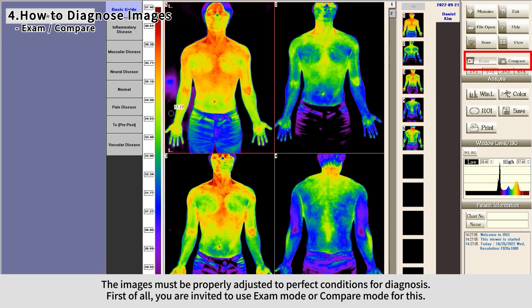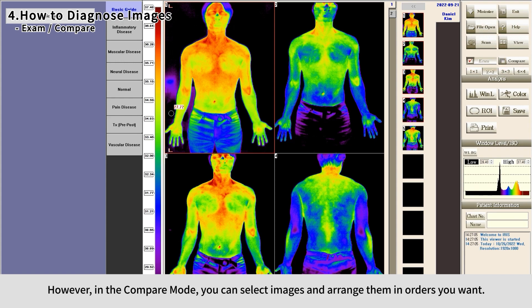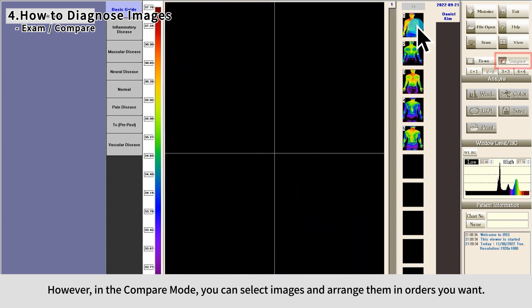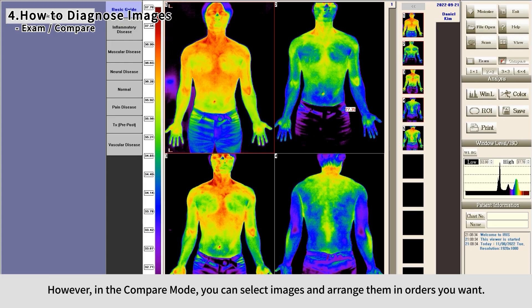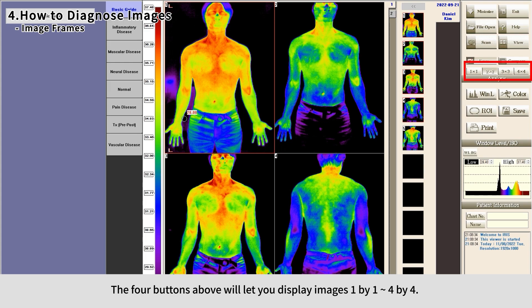You can use Exam Mode or Compare Mode for reviewing images. Exam Mode displays images in the order they were taken. In Compare Mode, you can select images and arrange them in any order you want. The four buttons above let you display images from one by one up to four by four.